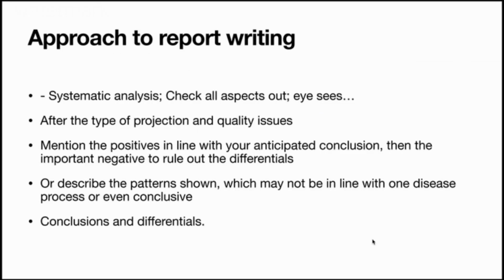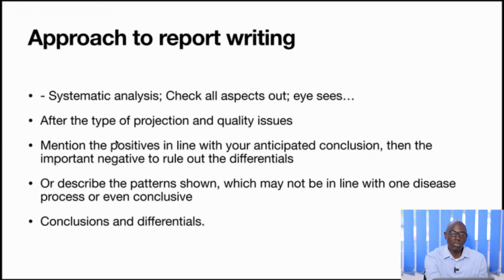You can either mention the condition that you know, and then do a systematic analysis, checking all aspects of the chest, just like we have listed up there.